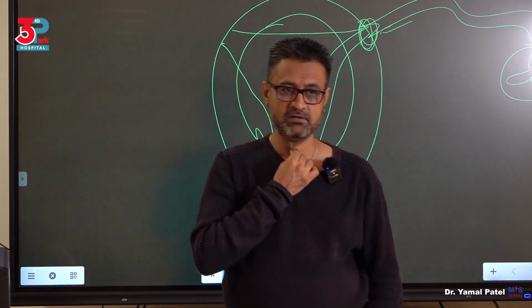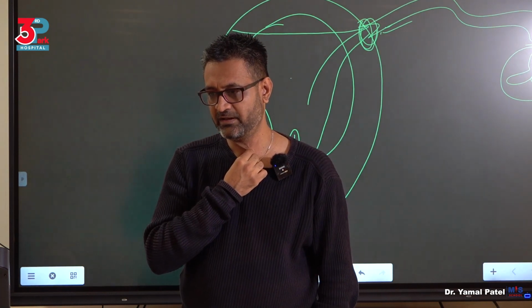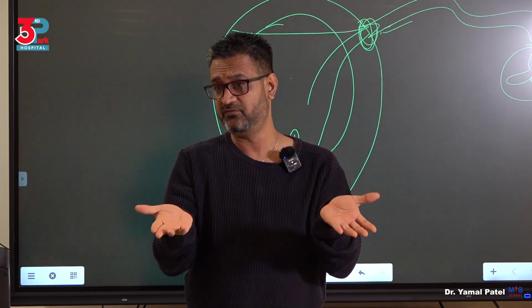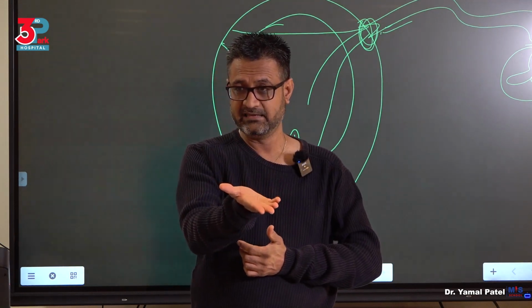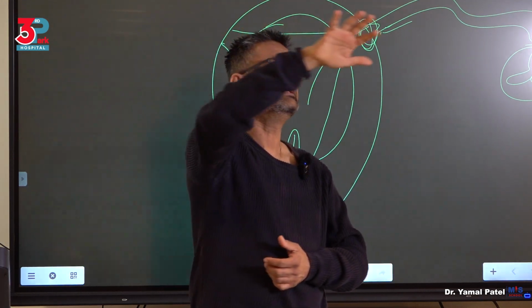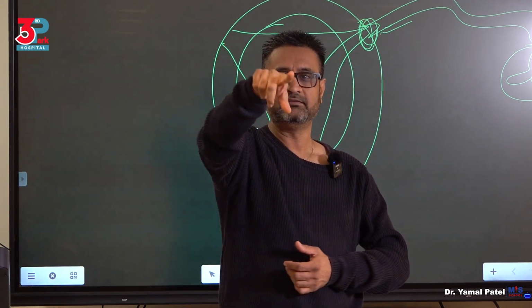Vaginoscopic approach. My team knows exactly what I mean by that, and they do it all the time. Vaginoscopic approach means you first enter the vagina and distend with the fluid. When you distend the fluid, you will see the vaginal wall. So you can also do vaginoscopy and say, okay, this wall is fine. This is the rugae. What is this small nodule here? Why is there this vaginal polyp? You get what I'm saying?